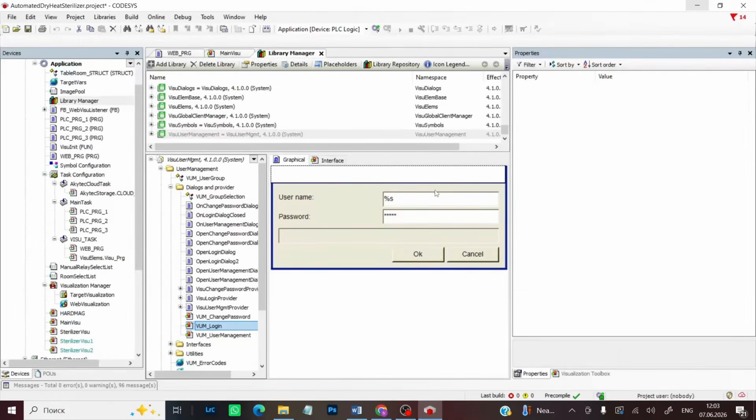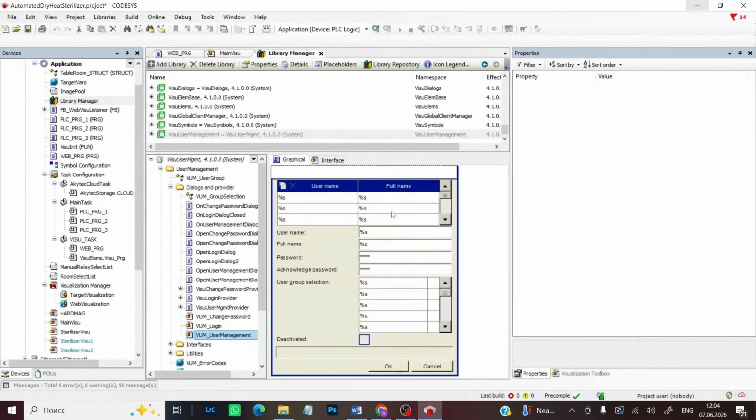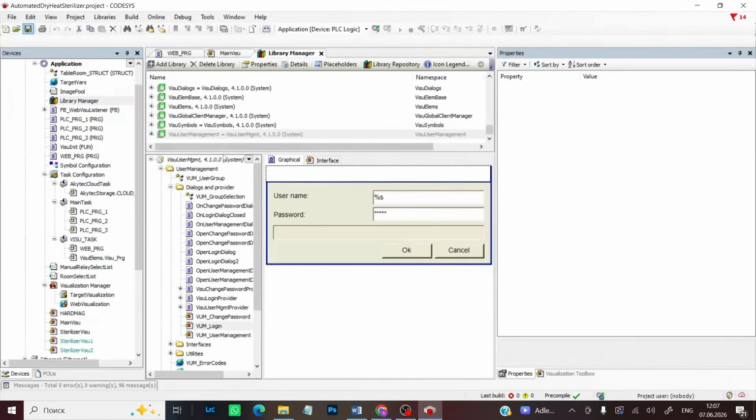When this button is pressed, the corresponding window from the Visu User Management library will pop up. For example, this could be the authorization visualization or the user management visualization. But here's the problem. In this version of the library, the functionality of these dialog windows is broken, and it's impossible to roll back to an older or newer version of the library because it's tightly bound to the version of the CODESYS IDE. One way to work around this bug is to enable the Support Client Animations and Overlay of Native Elements option. However, this solution doesn't work for devices whose chips don't support overlay technology, and it doesn't always work even for devices that do support it.